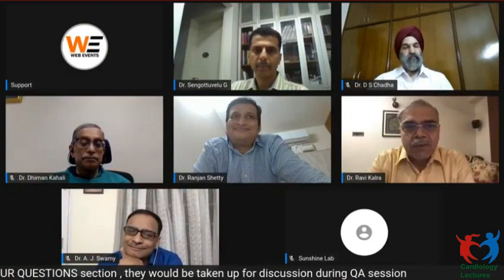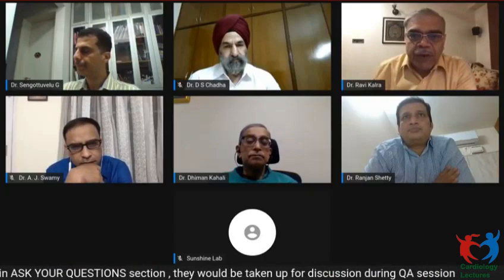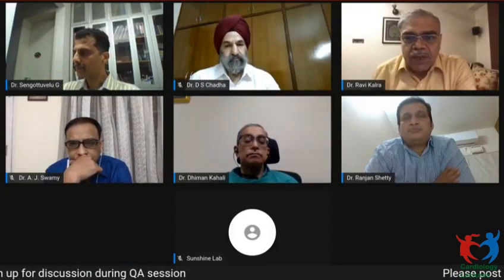Just one point. You mentioned the importance of the final kissing balloon, but I think it is equally important to do a good re-POT at the end, a final POT, because we do find an elliptical shape, unless you've been very careful with the size of the balloons. So a re-POT, I think, is as important as a final kissing balloon.